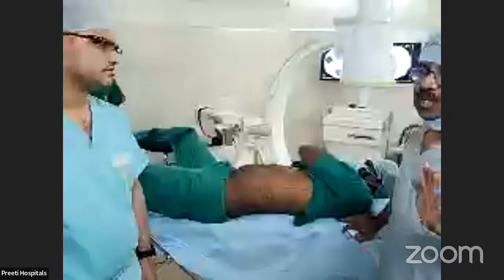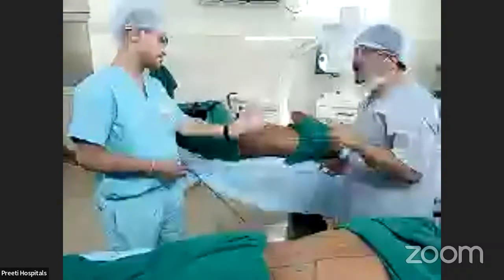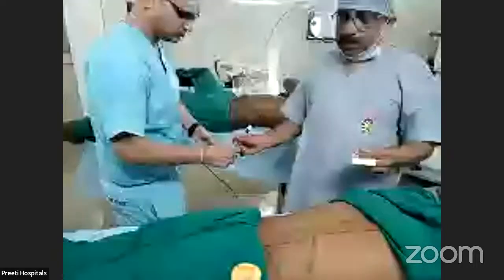One option, calyx you can go, but if it is projected... if we have a stone, the kidney is like this, and the ureter is like this. So you have upper pole, lower pole, mid pole.